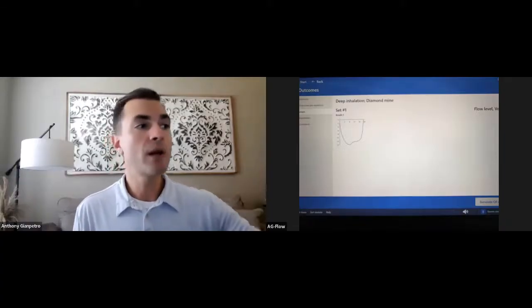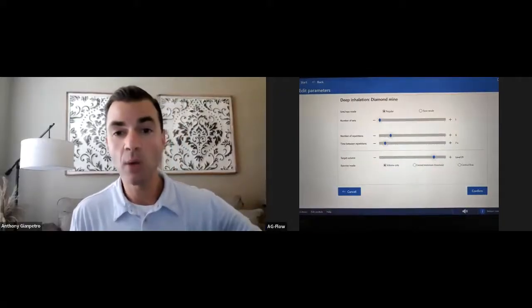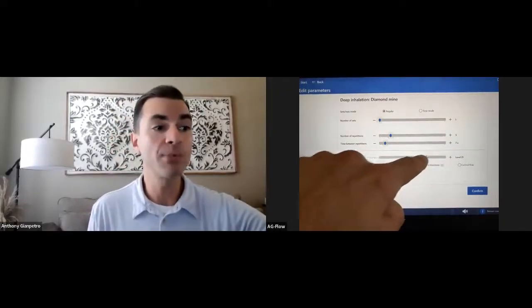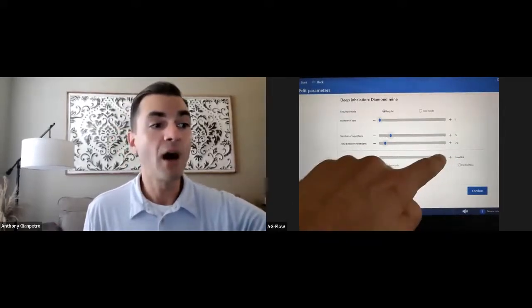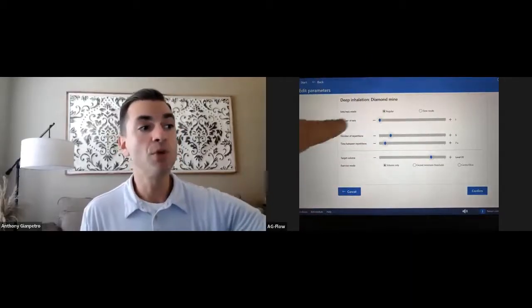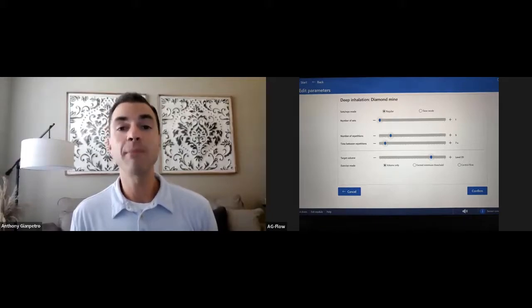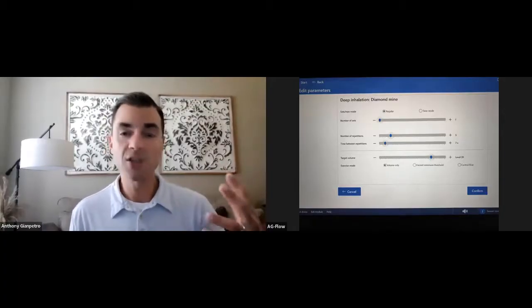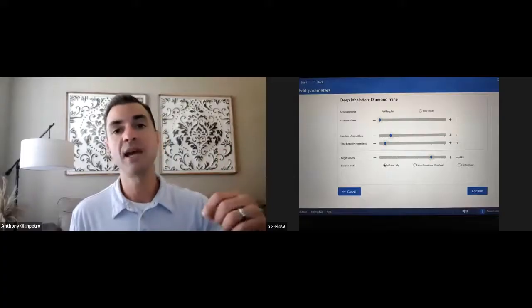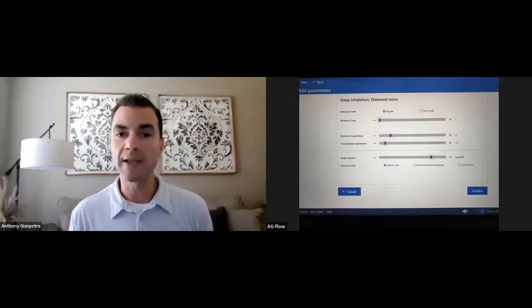Okay. So again, quick review. I'm just going to go back to the parameters. If that volume, I had it set at 21. If that was too hard for me, I would just simply move that down, or I could move it higher if it wasn't hard enough, right? The other idea is within that set volume, you can adjust your sets and reps as needed. And most RTs that are worth their salt are going to tell you aim for a good set of about 10 breaths of any activity per waking hour. So that's what I want you to keep in your mind. When you're just getting started, try to think in your head, one set of 10 or two sets of 5, build from that. Okay. And then we can get to more evidence-based loads as needed.